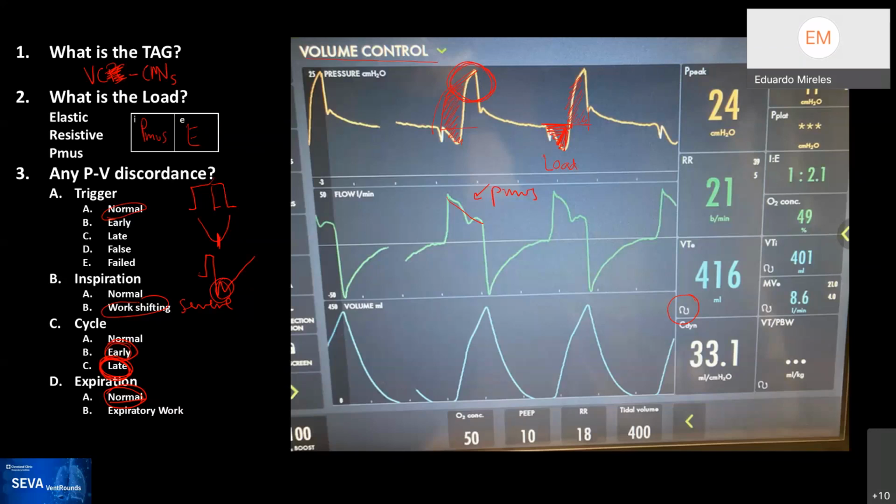But that's different than the patient actually bearing down and raising the pressure, if that makes sense. So he relaxes, and what that pressure represents is actually the pressure with the tidal volume inside your lungs, and what you're seeing there. Yeah, if he was bearing down, it probably wouldn't be such a consistent peak in inspiratory pressure. Right, it'd be all over the place.